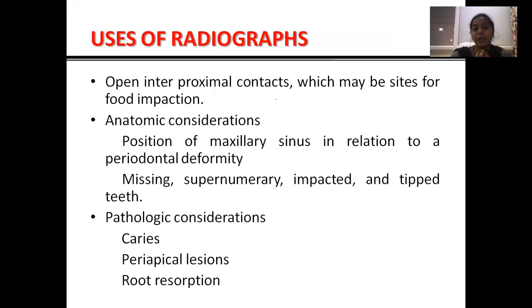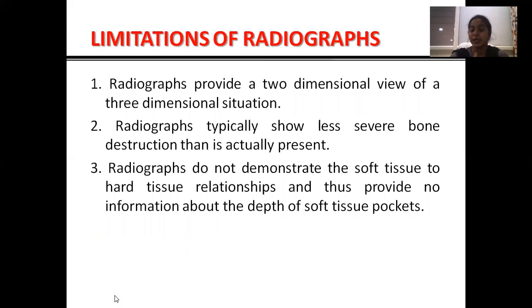In case of open interproximal contacts, which are the sites for food impaction, we can prescribe the radiographs. Or in case of implant placement, wherein you want to know the position of the maxillary sinus, you can prescribe the radiographs. In case of caries and periapical lesions, we can use the radiographs.